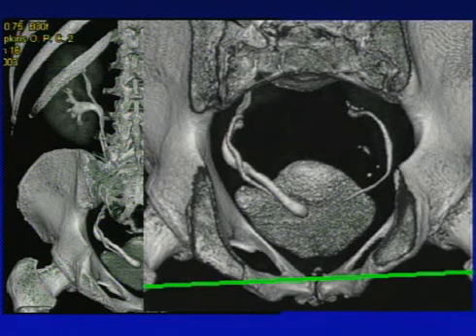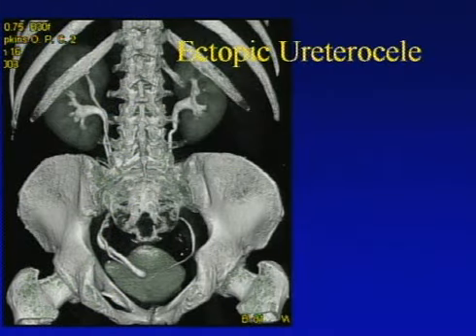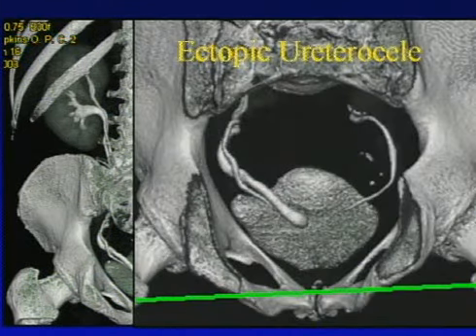If you want to look at the bladder, giving IV contrast really is not good enough. If you want to get detailed views of the bladder, we'll put a Foley in the bladder, then drip in up to 500 cc's of saline mixed with 30 cc's of contrast. Do that under gravity. That's the ideal way, whether it's a trauma situation or in looking at patients with suspected tumors. Giving IV contrast and then waiting 8 or 10 minutes is just not going to distend the bladder enough. So you really need to recognize that.